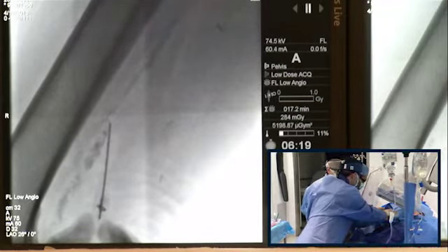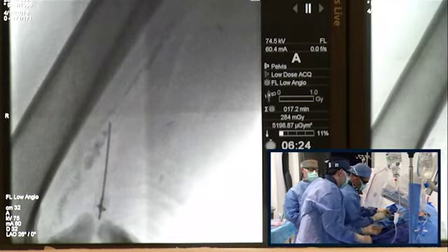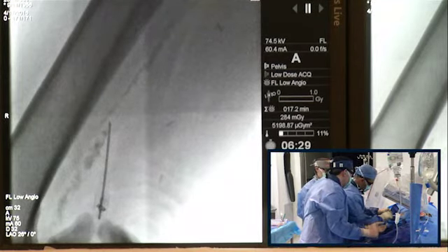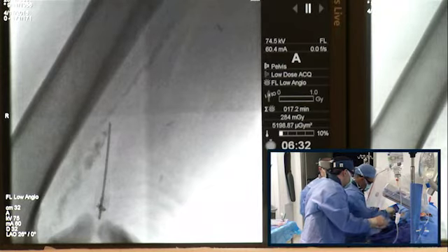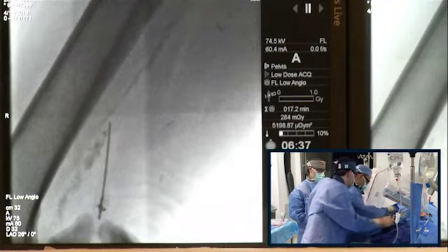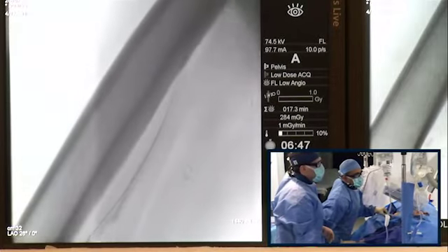And you can feel it actually. So we got a little bit of return. So let us look at it here for a second, whether it is arterial or venous, sometimes it could be venous. I'm going to explain why I went for this versus the AT, which I think is a very good point that Thomas raised. But let us just show this for a second. I think this is the vein, most likely. Yeah, this is the vein, which is fine.